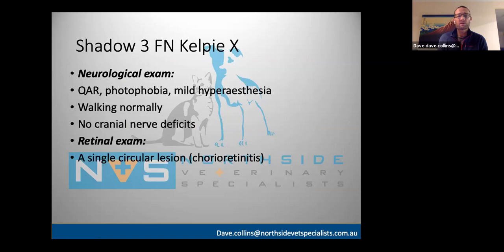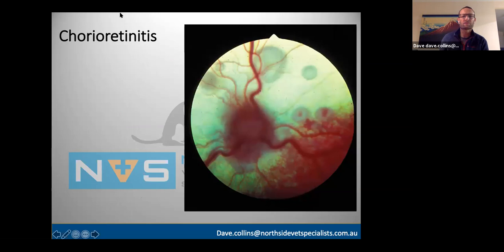Paul kindly looked at the retinas and found a chorioretinitis lesion. Again, this is not that dog, this is a cat, but a chorioretinitis lesion was identified. So, you know, we kind of knew what was going on here.